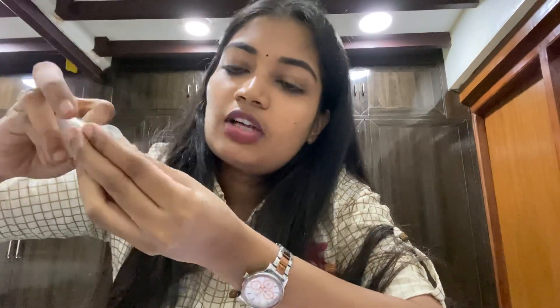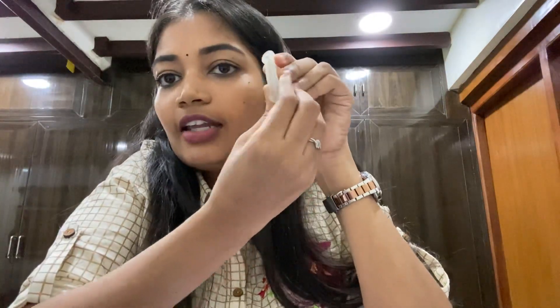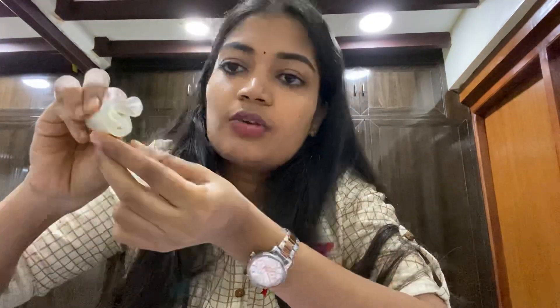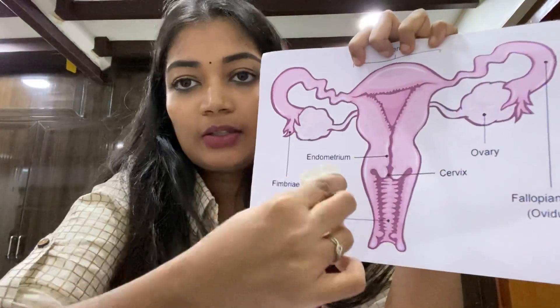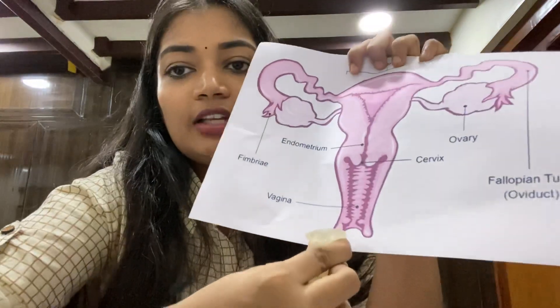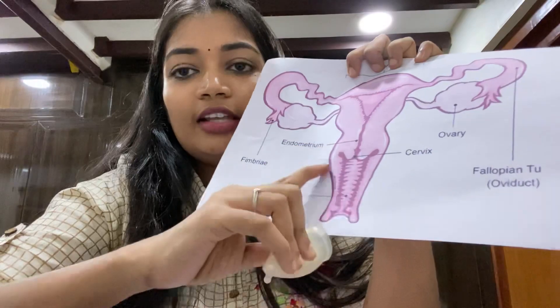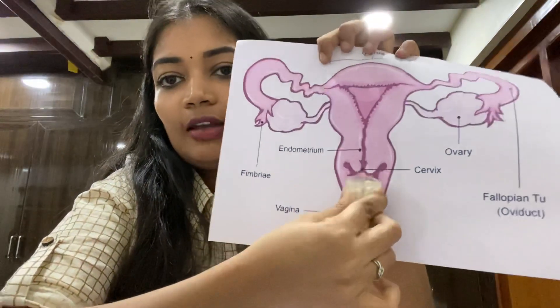There are other folds available as well. If one fold is not comfortable, try a different one. Use whichever fold feels most comfortable for you. Once folded, insert the cup into the vaginal canal in a comfortable position — it will seat tightly once inside.